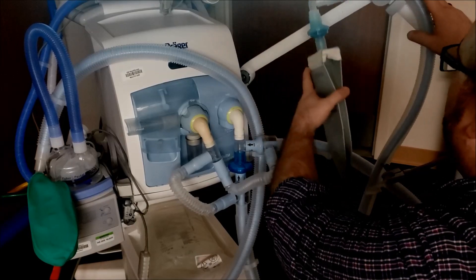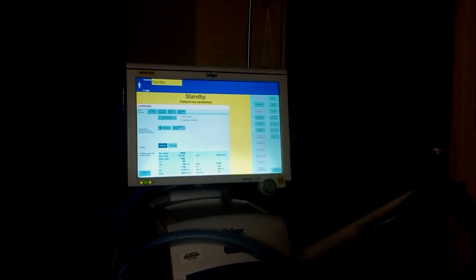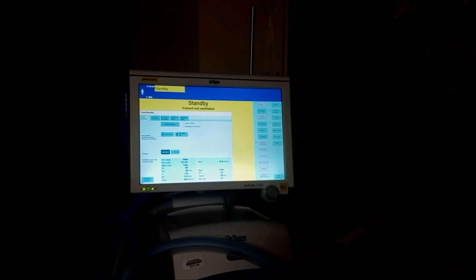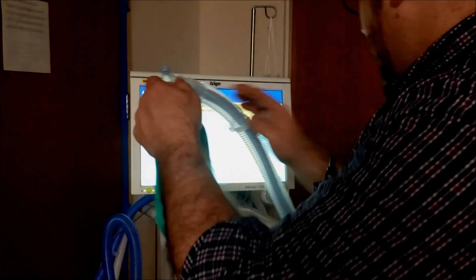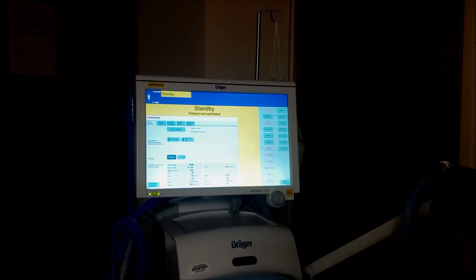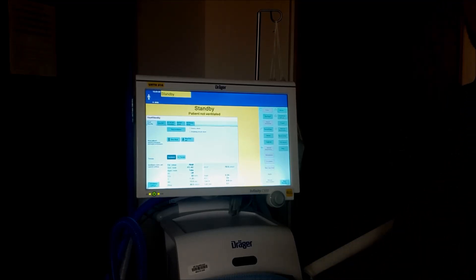There are a couple of real keys to this. When you're running this vent, aseptic technique is really out the door. This is more of what you're going to use in a pinch. Since we're not using active humidification, we're going to use an HME on the end of each circuit. Highly recommend if you're going to do this and have to run two patients off of one ventilator — you will be ventilating patients that are sedated, paralyzed, totally out of it. You just need to ventilate them.